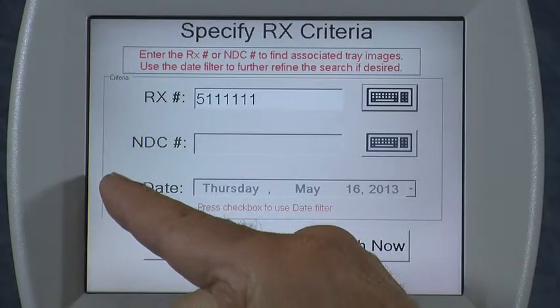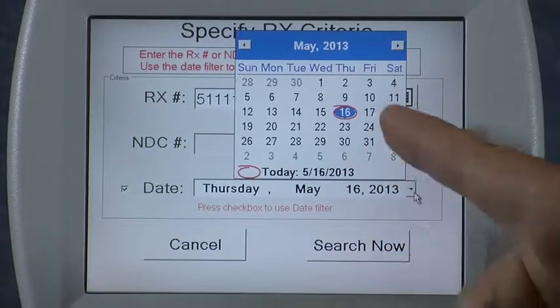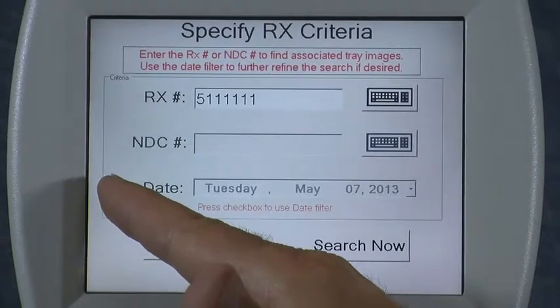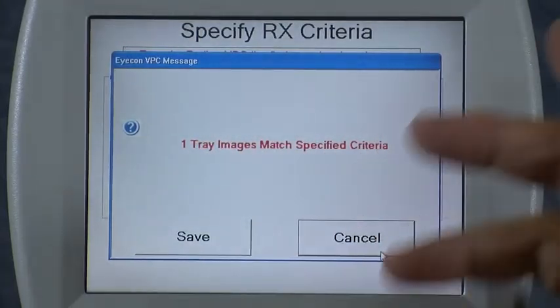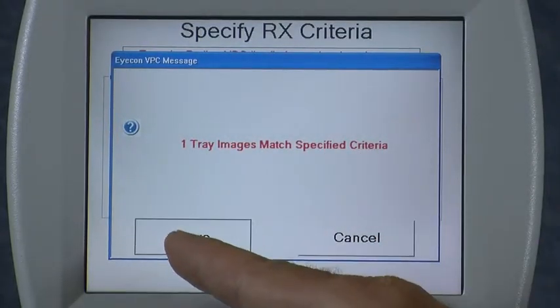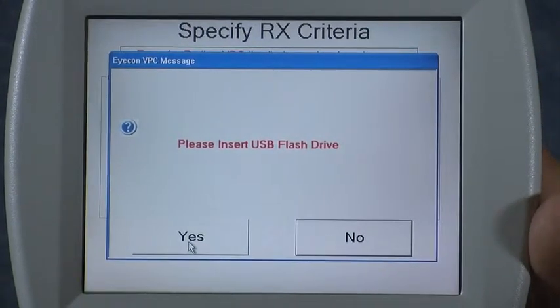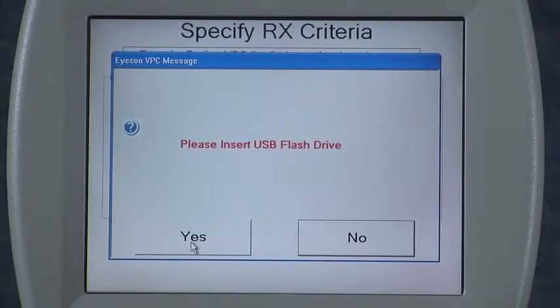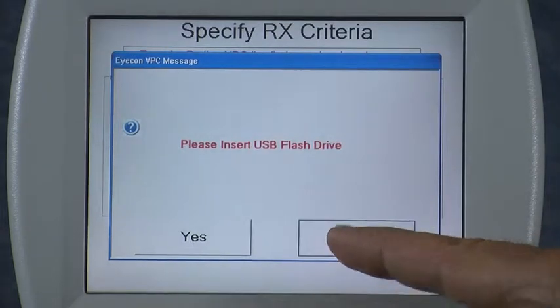If you want, you can also specify a date if you know the exact date, but it's not necessary to do so. You simply pull up that menu and specify a specific date. I'm going to turn that off so it will find it no matter what. Then I hit the search now button and it tells me it found one tray image that matched my criteria. If I press the save button, it copies that saved image into a separate folder on board the icon's hard drive, making it accessible over an ethernet connection. It then asks if you'd like to save that to a USB memory stick — it's much quicker to access it directly over your network connection.